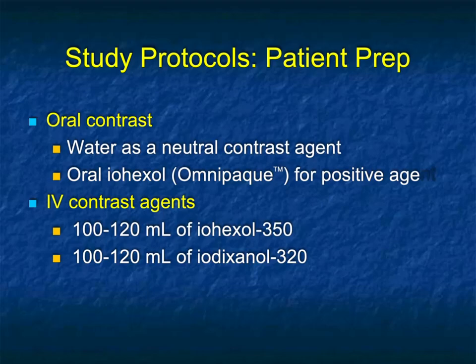And then, of course, to look at the liver, you need IV contrast. In the old days, Mike Federle used to speak about how you always also did non-contrast scans. The main reason for doing non-contrast scans, he felt, was looking at cirrhotic patients and trying to figure out if regenerating nodules versus hepatoma or the lesion's dense. The main reason for doing non-contrast CT scans, or at least several of them perhaps, is just to get a density of the liver without contrast. Sometimes fatty infiltration of the liver is easier to quantify on a simple 2-slice study with non-contrast scans.